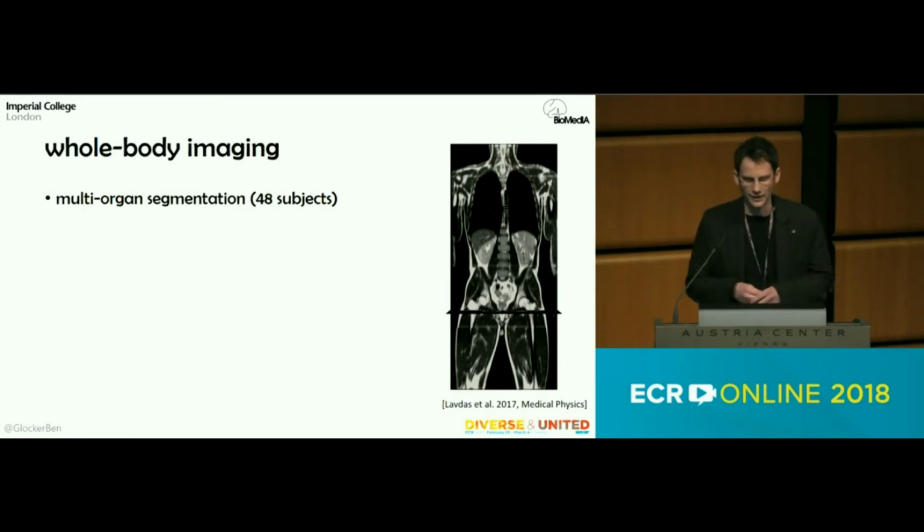whether you have metastasis. Unfortunately, those scans come with lots of slices you need to look at, and obviously doing the visual manual inspection of all those slices will just add to the time that you need to spend in front of the screen. So we are trying to develop a system that does automatic analysis of those whole body images.